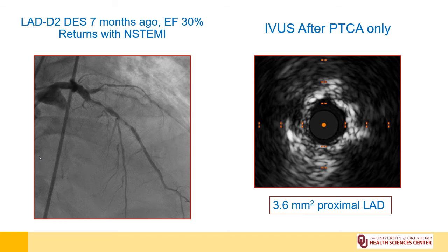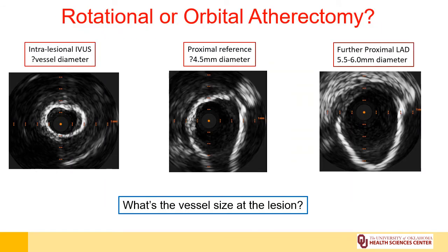And here you can see that there is 3-quadrant calcification. In this next slide, you can see that there is actually concentric calcification in that proximal LAD. By the way, this patient was not a candidate for CABG, and therefore a percutaneous route was used. The problem is, what is the actual diameter of the vessel there? Because in concentric calcium, you cannot see it with the IVUS very well, and even with OCT, you will not be able to tell the size of the vessel.